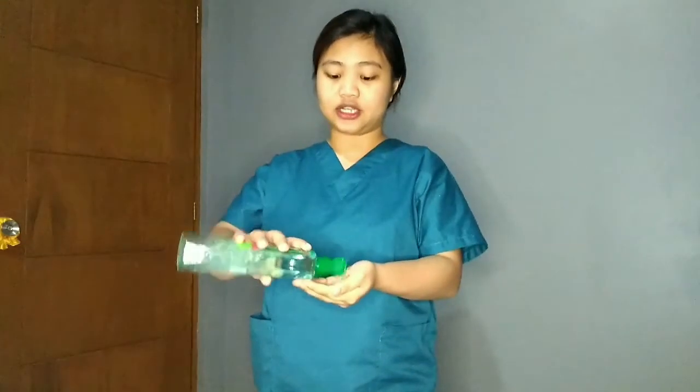After all the procedures that you do with your patient using those assistive devices, don't forget to wash your hands and do proper hand hygiene. Assume that I already washed my hands, so I will apply the alcohol, and if you have hand sanitizer, you can use it to sanitize your hands. And after that, don't forget to ask your patient to report any numbness or dizziness in the upper torso.